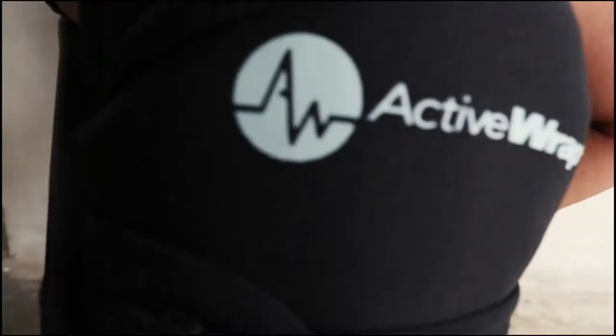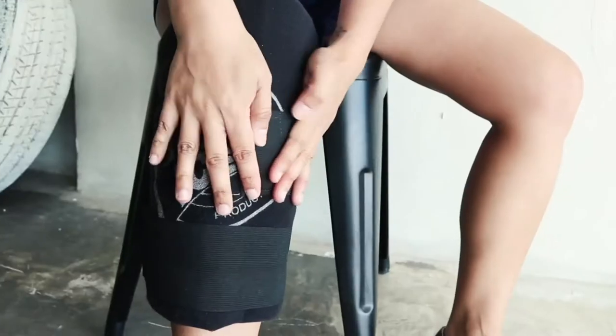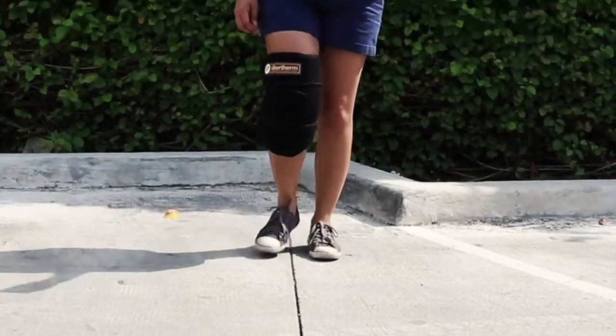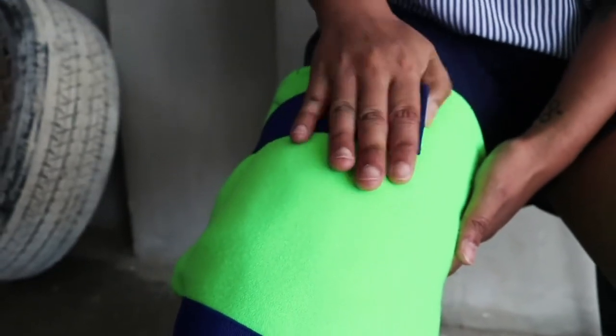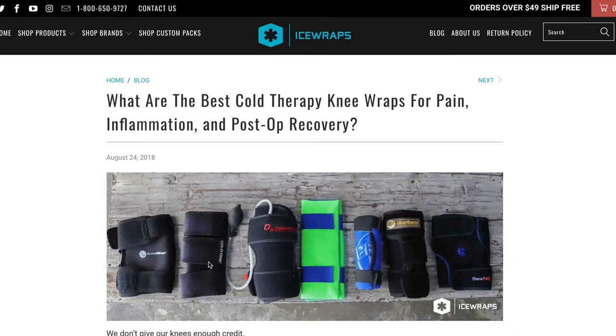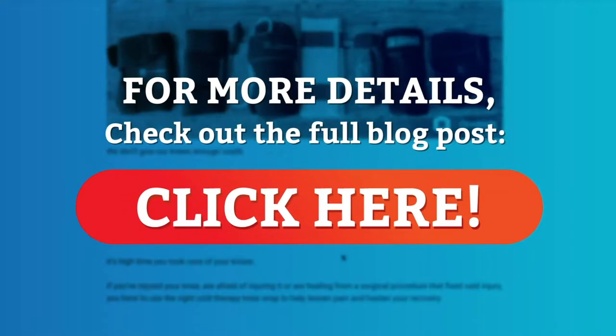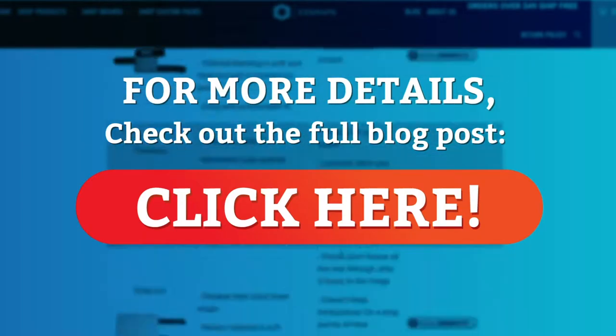In this video, we've rounded up 7 of the best knee wraps in the market today. We ranked them according to their level of comfort, durability, ease of use, and of course, their ability to stay cold for a long period of time. If you want to know the nitty-gritty details on how we did our testing and evaluation, check out the full blog post. For now, let's see which knee wraps are the best for cold therapy.